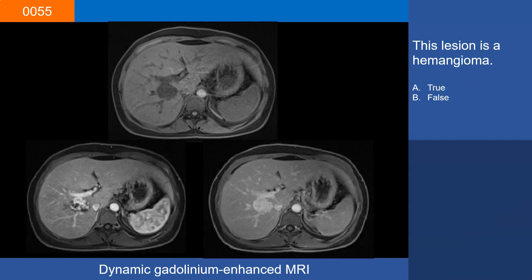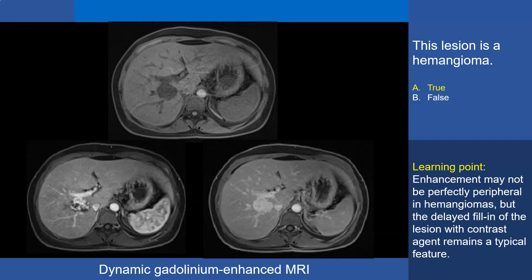Case 55. This lesion is a hemangioma — A, true, or B, false. The correct answer is true. Although the enhancement on the early arterial phase is not typically peripheral, the appearance on the delayed images of near total enhancement of the lesion is typical of hemangioma. The learning point is that enhancement may not be perfectly peripheral in hemangiomas on early dynamic gadolinium-enhanced MRI, but the delayed fill-in of the lesion with contrast agent remains a typical feature.